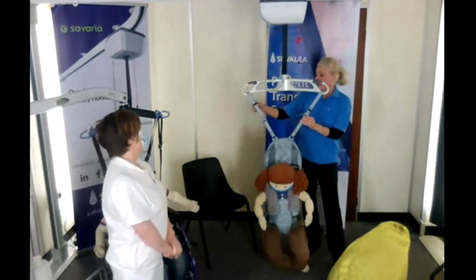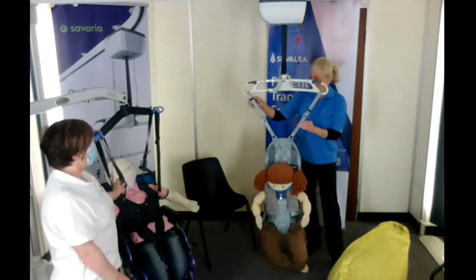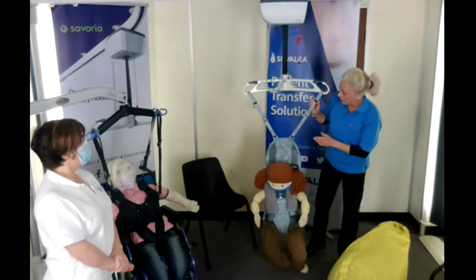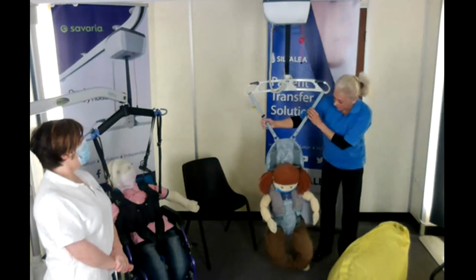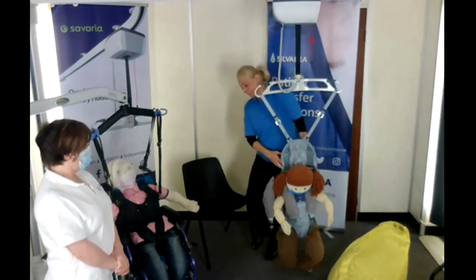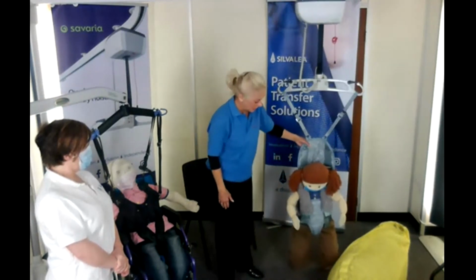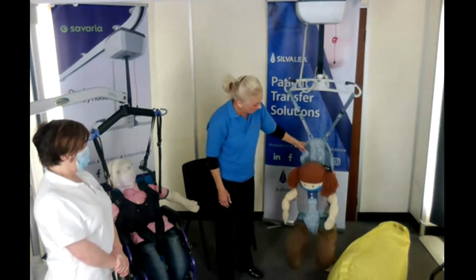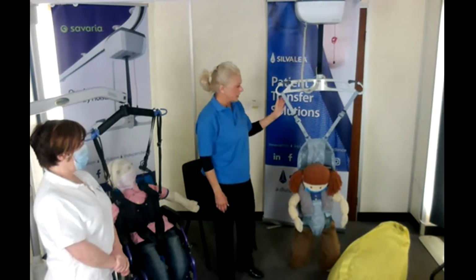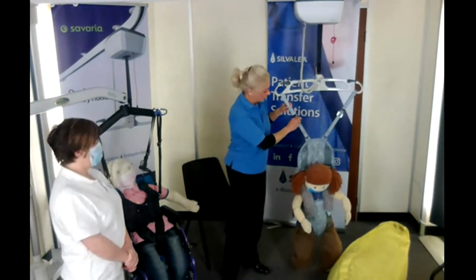This one actually has got the little slider. We talked just earlier about the metal D-ring. This has got the little plastic slider. Hopefully you can see that. That just gets pushed out the way there. So yeah, great little harness. We call it the Jolly Jumper. So just to give you an idea, it's like the baby bouncer. Again, think about your spreader bar. This one, as James explained, is an adult one, but there's lots of adjustment here, and then you can shorten the tapes if you need to.